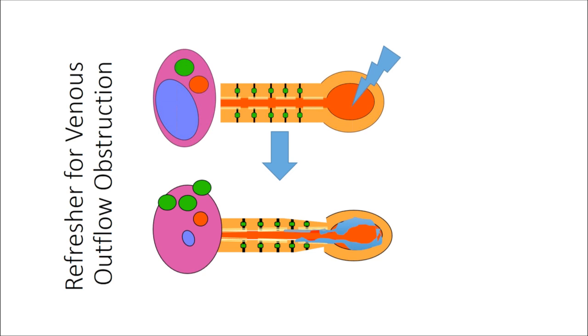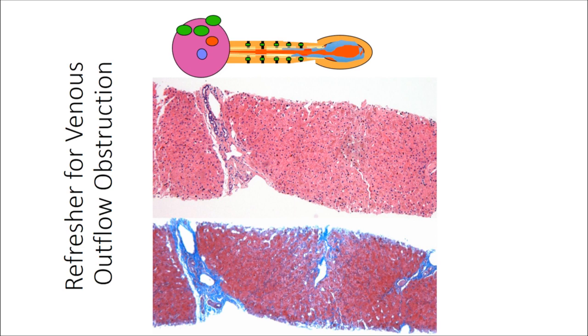That pressure then flows back to the portal vein, causing its diminution in size, and actually causes bile ductal proliferation through a pressure-initiating event, and may, in point of fact, present in a cholestatic manner, in which this patient presumably does. So this would be the liver biopsy expectation in light of venous outflow obstruction. Now let's go to this patient's liver biopsy if, in point of fact, she does have venous outflow obstruction, and this is what we would expect her liver biopsy to look like.